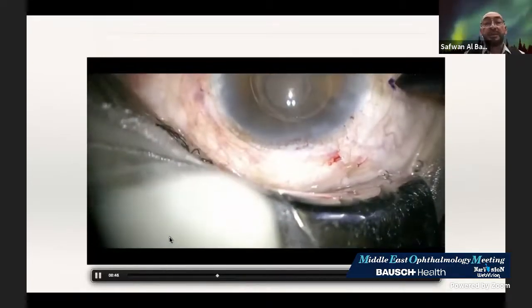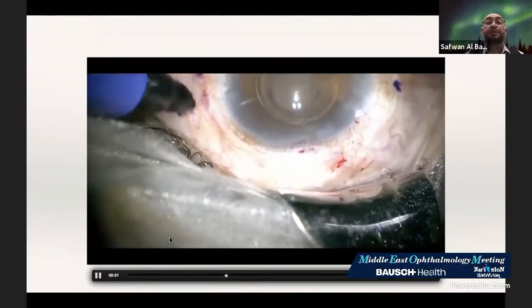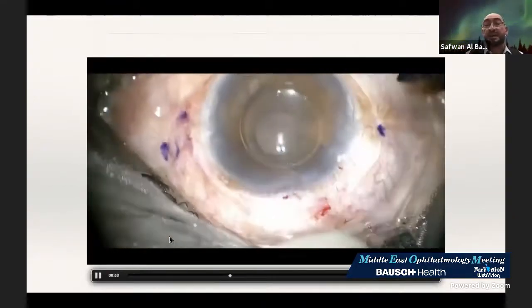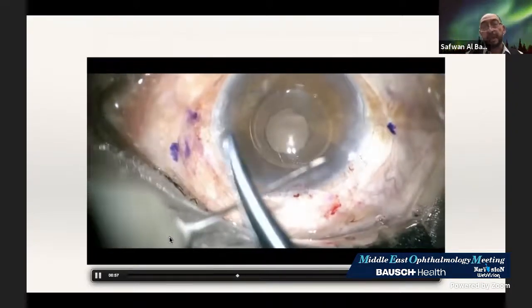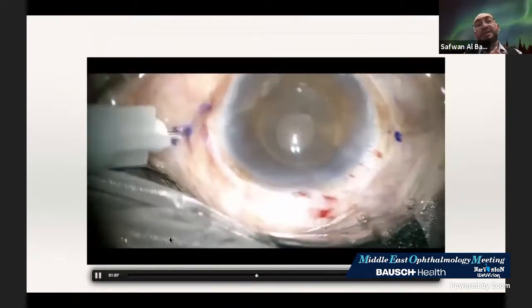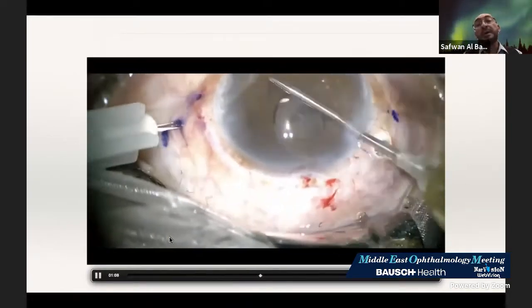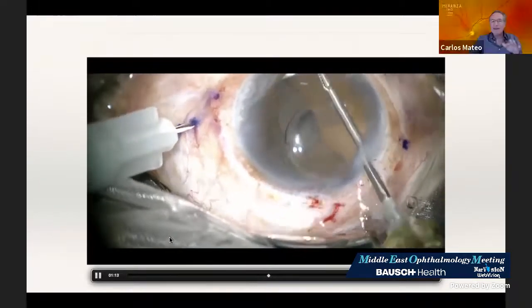The marker was 2 millimeters. See, here 2 millimeters, and then 2 millimeters. So I used 2 by 2, but it wasn't clear. Unfortunately, the camera was in the center. Here I used 9, not 9 and around 10, or sorry, 11. No, I used 9 for both. And I used the old technique, Safwan, the leading haptics first.